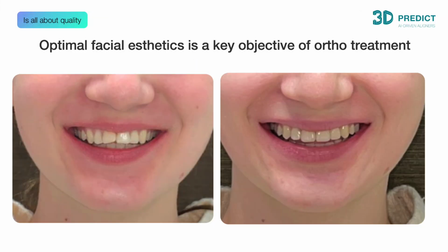Just discussing the smiling picture for this patient too. We see on her initial picture a reverse smile line and a deviated midline. Thanks to this, the technician was able to plan for a convex smile result and an aligned midline, much more aesthetic.